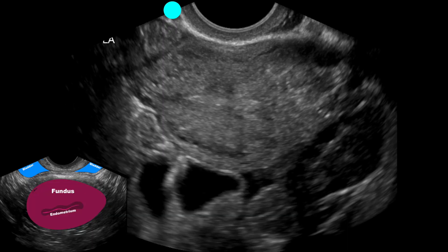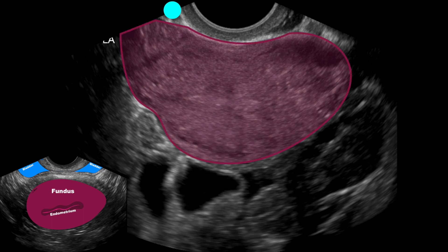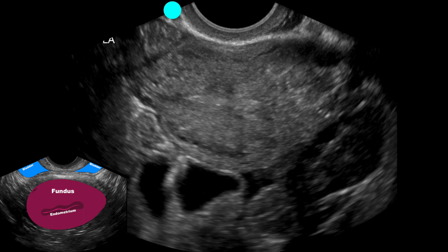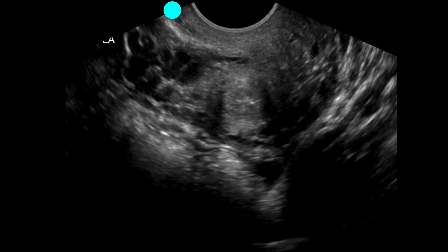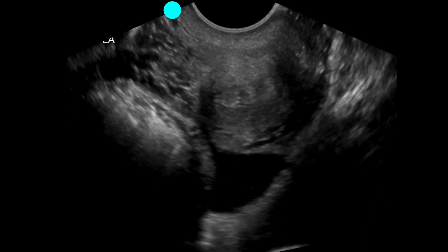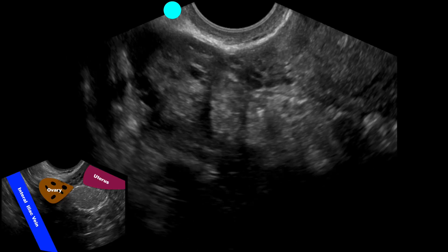We rotate the probe marker to the patient's right and are now in a short axis view. Outlined is the uterus; we see more contained fluid likely representing loops of bowel. We keep in mind the endometrial stripe as we go from the fundus down through the cervix. Continuing to scan, there are no intrauterine contents. Moving more inferiorly, we again notice more free fluid, which is better evaluated in additional images as we go through to the cervix.